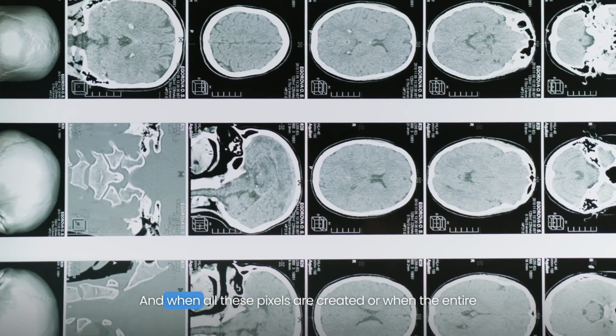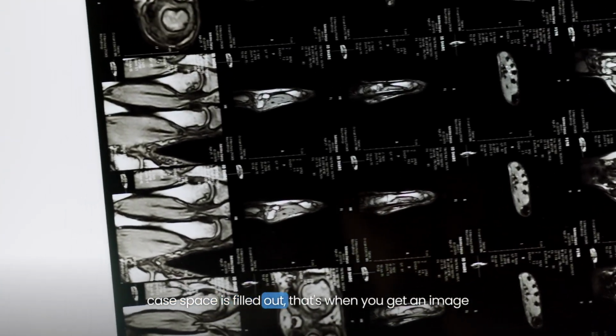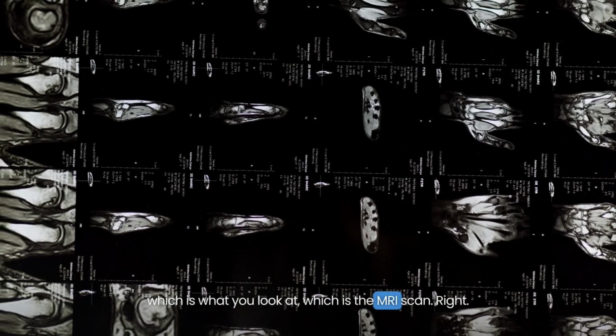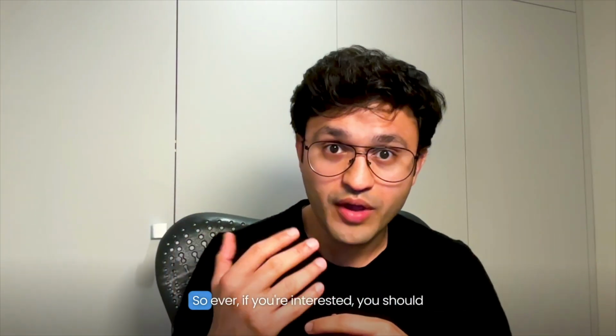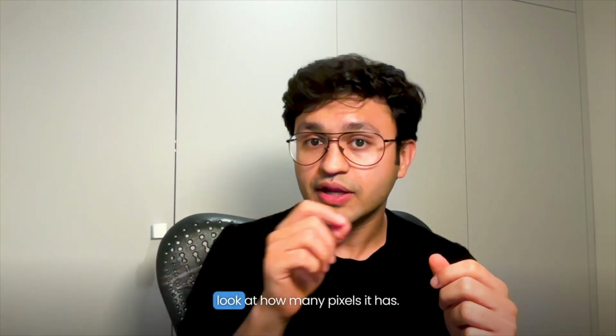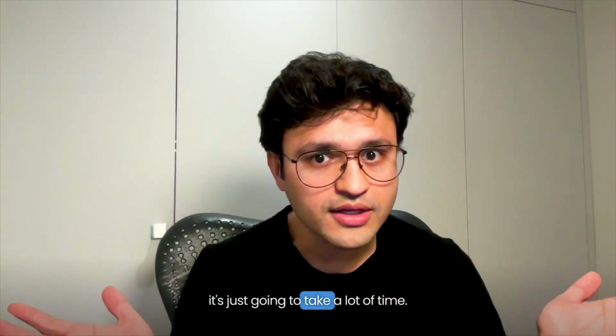And when all these pixels are created, or when the entire K-space is filled out, that's when you get an image, which is what you look at, which is the MRI scan, right? Now, for a clear picture to be collected, it needs to collect a lot of data, right? So if you're interested, you should look at a complete photograph and then look at how many pixels it has, and if you have to collect all those pixels, that's just going to take a lot of time.